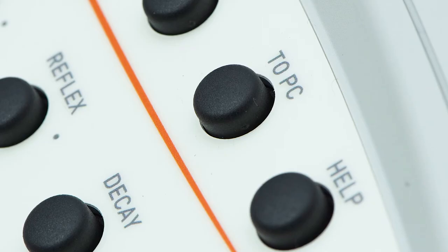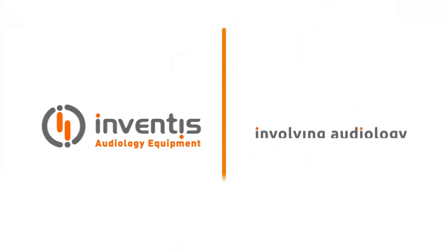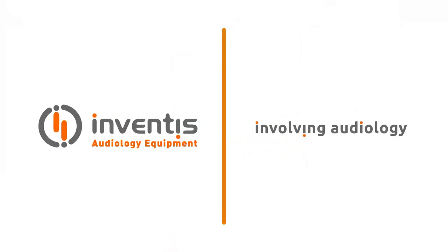When an examination has been completed, it can be transferred to the Maestro archive simply by pressing the To PC button on the instrument.